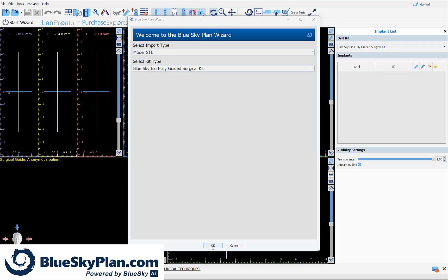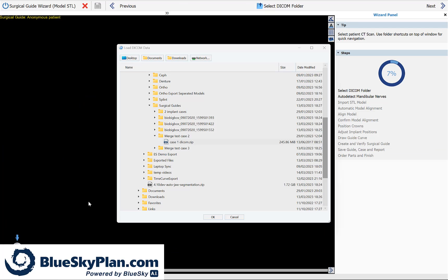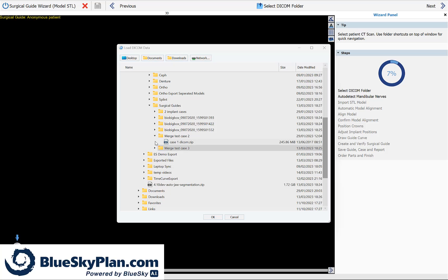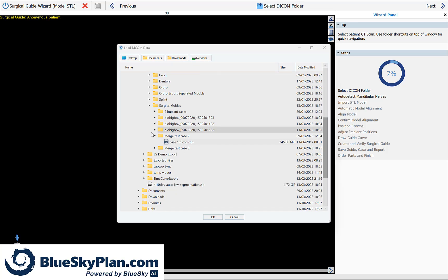The software now prompts you to load your DICOM CT data. It's showing you your computer's folders and directory and your shortcut buttons on the top to your desktop, to your documents, to your downloads, and to your network if relevant. Navigate through the folders and directory to find the CT scan.